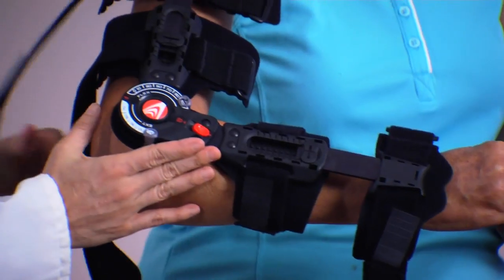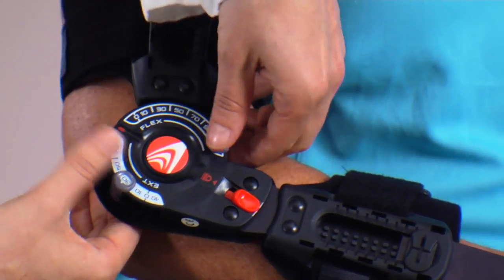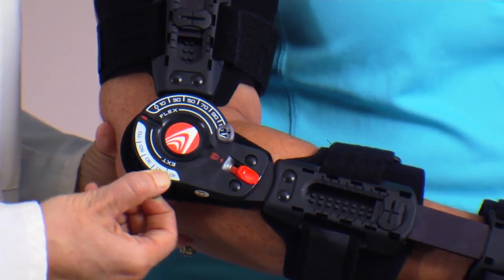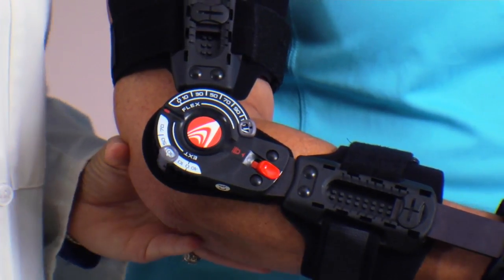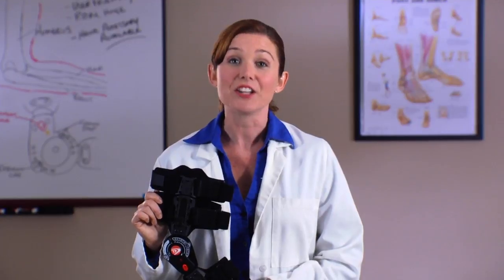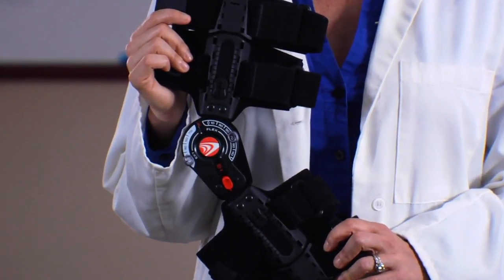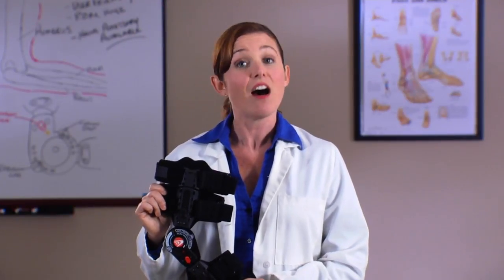The patented user-friendly T-Scope Premier Hinge can be locked out to restrict flexion and extension at any angle to control the range of motion of the patient's elbow. When worn correctly and for the length of time prescribed by a medical professional, the brace helps post-surgery patients recover safely and comfortably. T-Scope Elbow Premier Braces will not prevent or reduce all injuries. Proper rehabilitation and activity modification are also an important part of a safe treatment program.